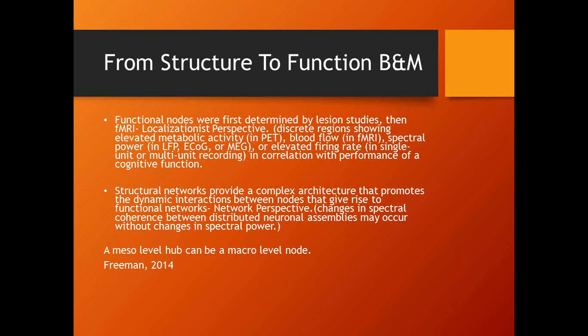And that was very hot in the 90s, and Corey Hammond and I got together and connected the MRI, the Brodmann areas, with the EEG 10-20 system, and we got it from the Key Institute. And then I put all the research I could find existing at that time into a chart on what areas lit up on the MRI when somebody performed a task. And if you look at our map system, if people say, well, some of those terms are strange on the map system on the dashboard.